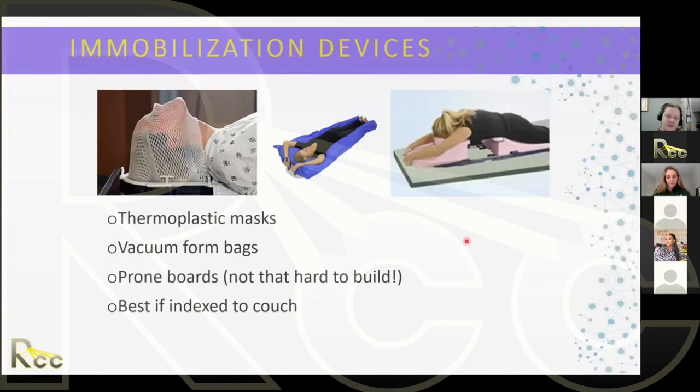The advantage is that most breast cancer patients have very good lung functions. They tend to be younger and healthier than some of our other patients. So they tend to be able to deal with breath hold very easily. We started out simply by verbally giving them the breath hold commands and switching the Linac on and off. And then eventually we implemented the external monitoring. So that's the way I would recommend going.